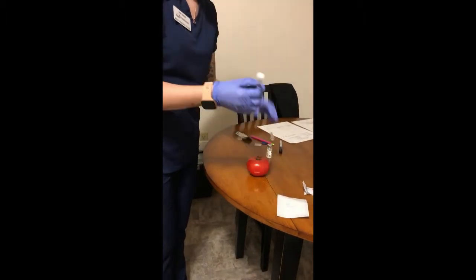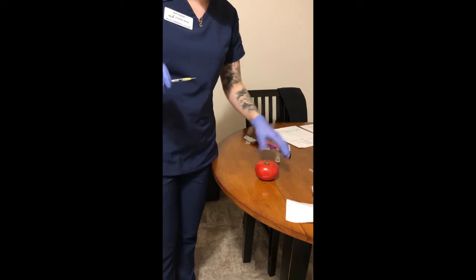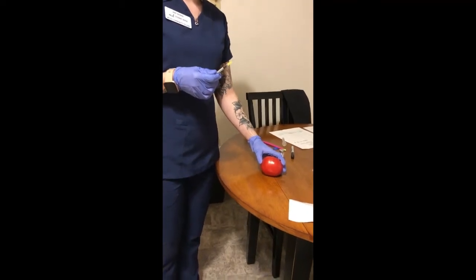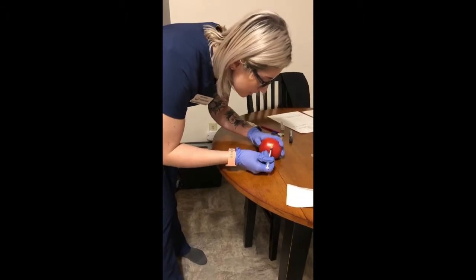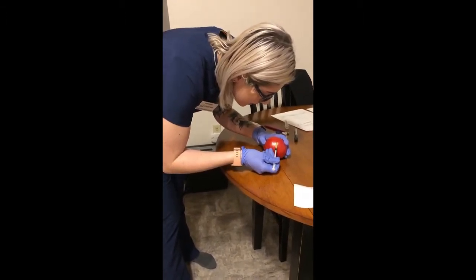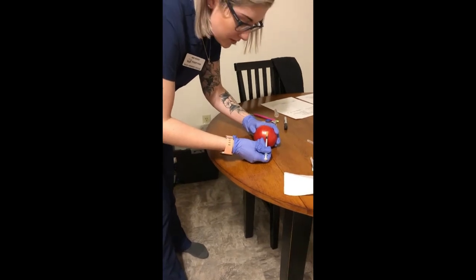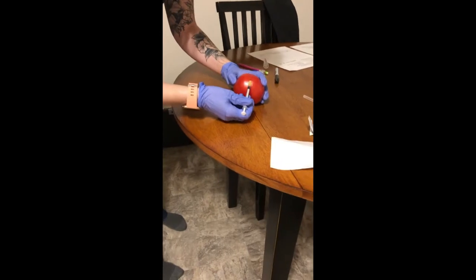I'm going to uncap my needle parallel to my body. You want to insert it with the bevel up at 5 to 15 degrees. So you're going to inject it slowly. And you want the bevel to be covered, so about 1/8 of an inch, and you can still see the needle through the top layer.